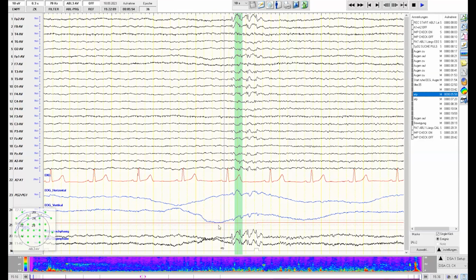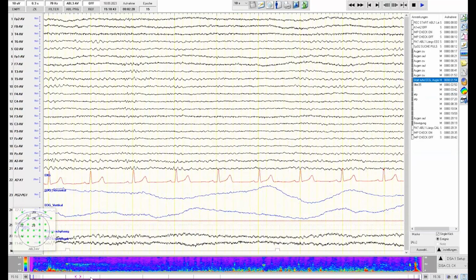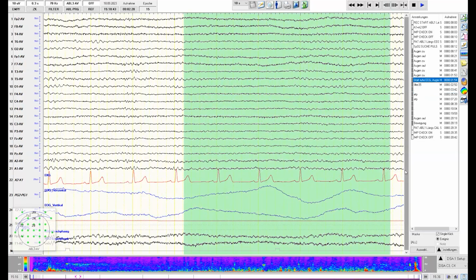Yeah. So the only other thing, I mean, there are things where you look, for example, at saccades from the more neurological point of view. From the psychiatric point of view, what you can clearly see and what is a very good and important measure is, as you see if you look at the screen again, you have these slow eye rolling movements, as you see over here. For example, here you have a rolling eye movement over several seconds. And this means the patient is very tired.